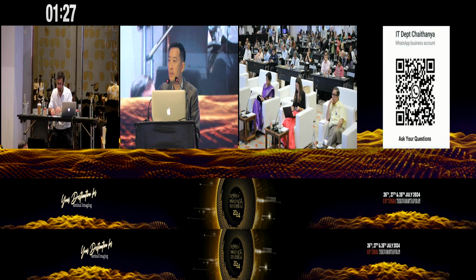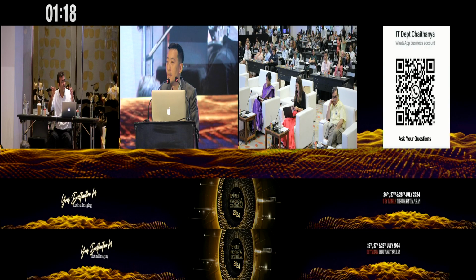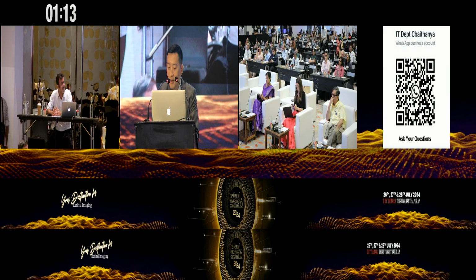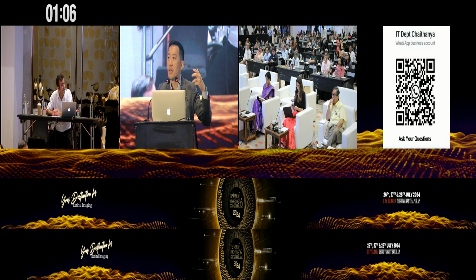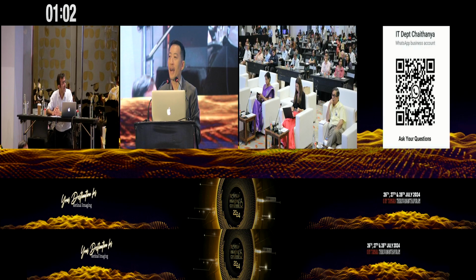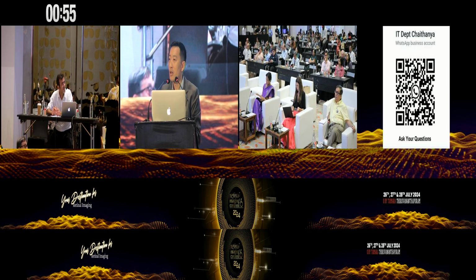Yeah, and as you know, I have interest in getting the 3D reconstruction of choroidal vessels, and I always wish that we could actually link these networks with the choroidal vessels. Did you try doing something like that? The fundamental problem with this is with lesions, everything under becomes very difficult to define on OCTA. So I'm not 100% sure of the accuracy of the choroidal vessels under the lesions and whether they'll be visualized correctly. Hence, the difficulty in combining these two techniques.